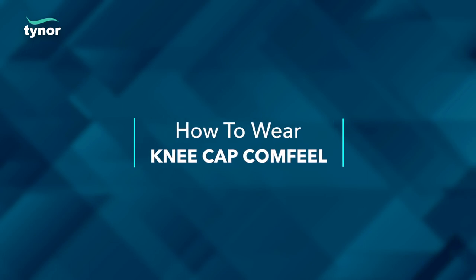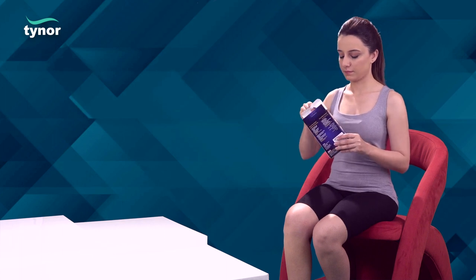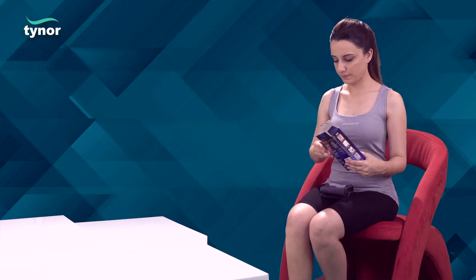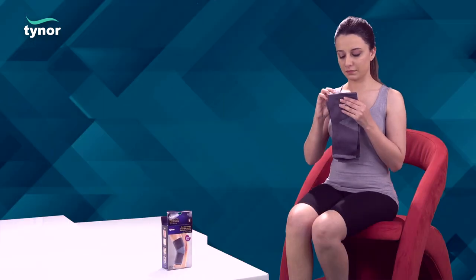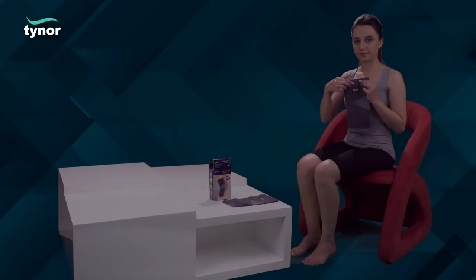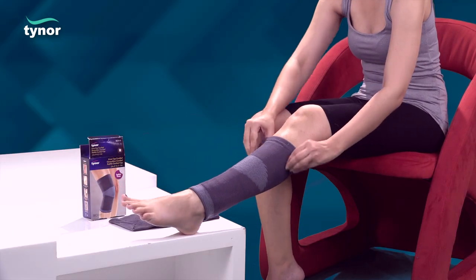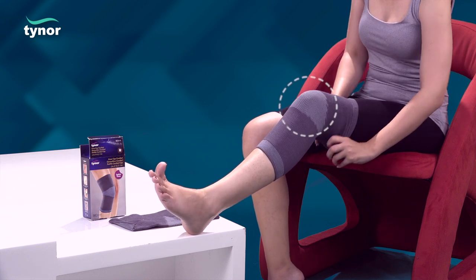Now, let us see how to wear the Kneecap Comfuel. Apply the product with the wider side placed upwards with a pull-on action. The patella should align with the striped portion.